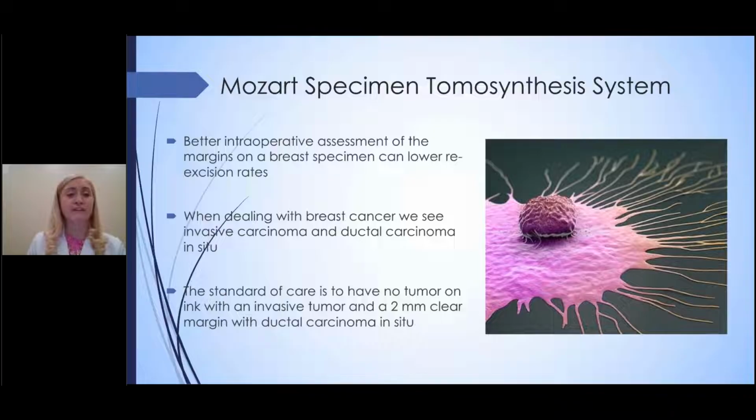And the whole point of intraoperative assessment of these margins is to lower our re-excision rates. When dealing with breast cancer, we see invasive carcinoma and ductal carcinoma in situ. The standard of care is to have no tumor on ink for your invasive cancers and a 2 millimeter clear margin for your in situ carcinomas. So that's always what we're looking for.